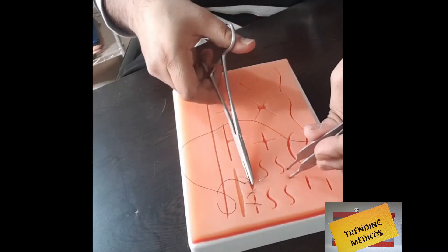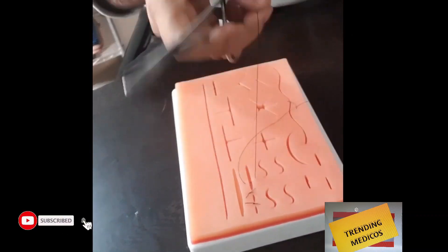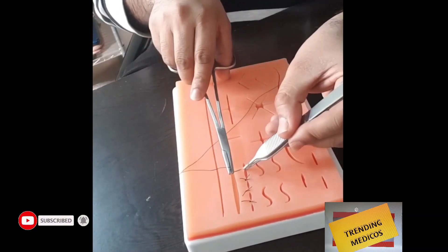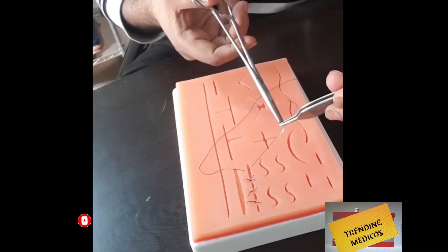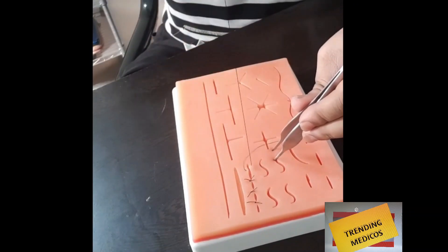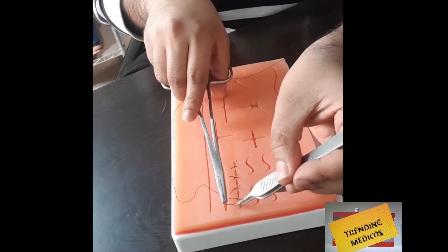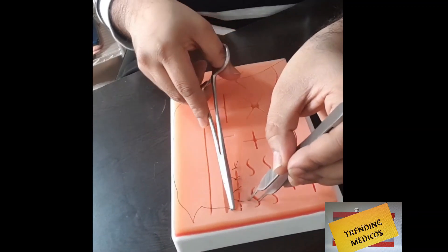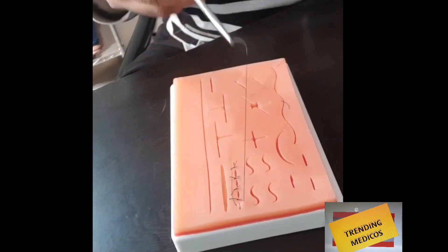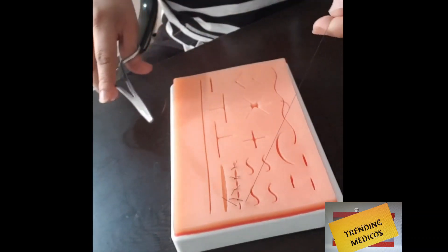The movement should be at the wrist joint. If there are gaps, you can go back and take another suture using the same method - the loop and reverse C loop.